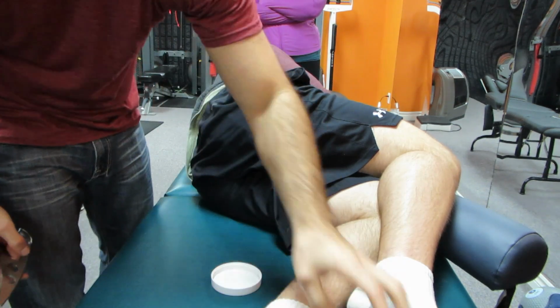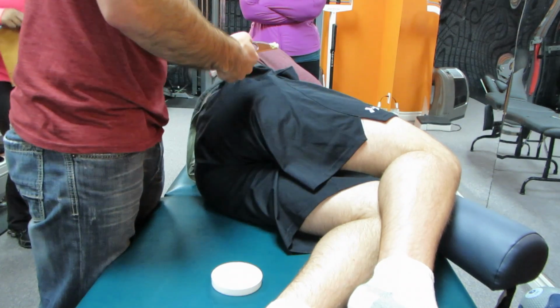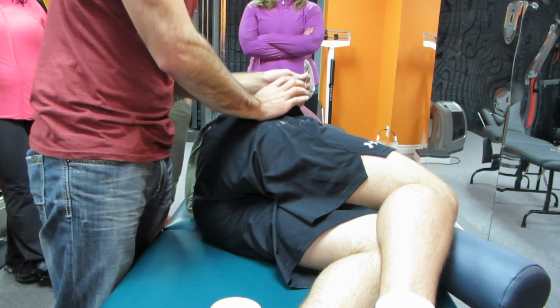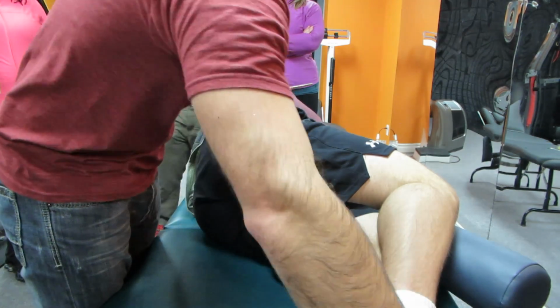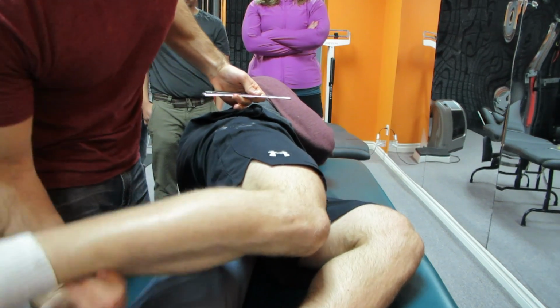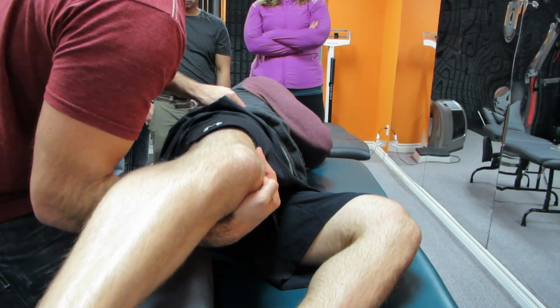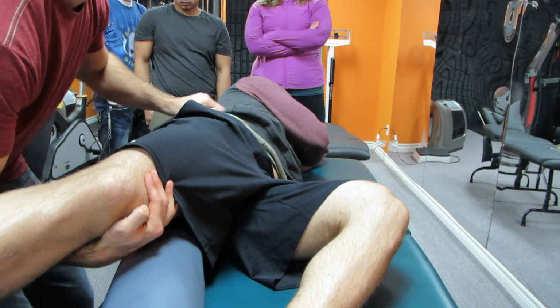Since he's on his side, we can treat TFL the same way. Pull these guys up, get a little bit through TFL, so that's just right off the front in there. With you guys to start off with, it might be easier to bring his leg back into a little bit of extension so we can treat it. What I like doing is grabbing a hold of that guy. Obviously if we didn't have the shorts on, it'd be a little bit easier, but we can get through TFL and bring him till I find that tension in there, okay?